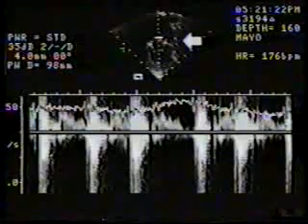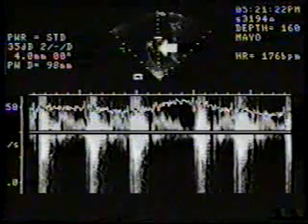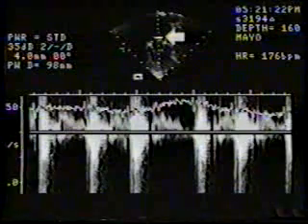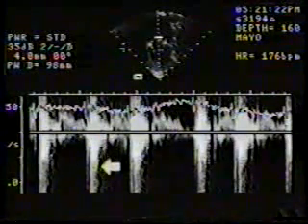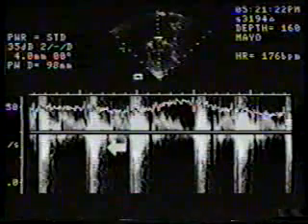The small image is an apex-down four-chamber view. These are the mitral prosthesis stents. The pulsed wave sample volume has been placed in the left atrium near the sewing ring. Mitral regurgitation is identified with unusual vibrations within the systolic envelope. In real time, you will hear these vibrations.